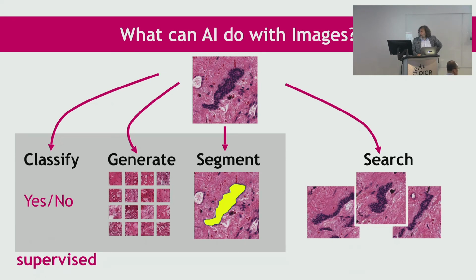And the supervised learning, again, the problem is that you need the pathologist to come and sit down with you, not one, multiple, and show you, draw in the image, delineate some regions of interest and say, this is malignant, this is not malignant, this is a cell nucleus, this is not a cell nucleus, and so on. Of course, this is not practical. We are doing it in a limited manner. You see some of the public databases, you grab 200 images, two pathologists mark them, you break it down in tiles and patches, you run some experiment with patches, and then you publish a paper. We report 98% accuracy. Everybody's happy. Well, on the computer science side, that's of limited use to actual pathology.